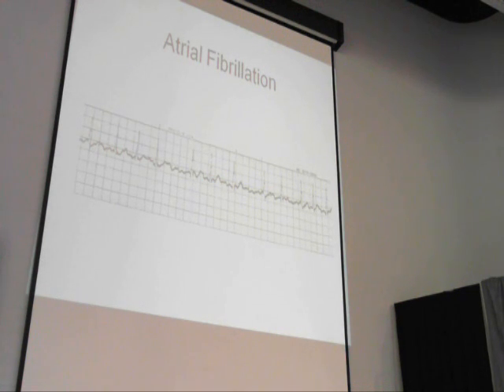Synchronized. It's so important. Cardioversion is synchronized electricity, and we cardiovert to calm down, slow down a fast rhythm. Why does the word synchronized go with cardioversion? What's the key there? What's the connection between synchronized and cardioversion?